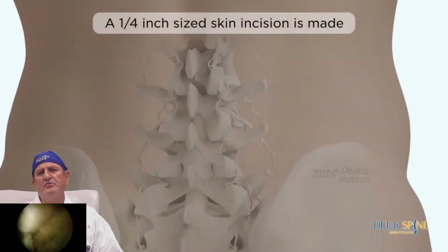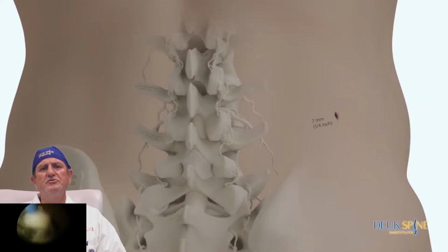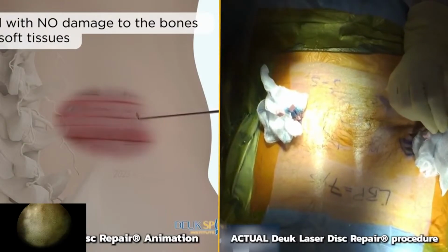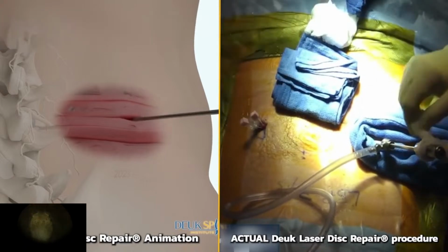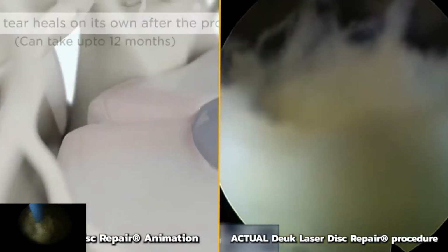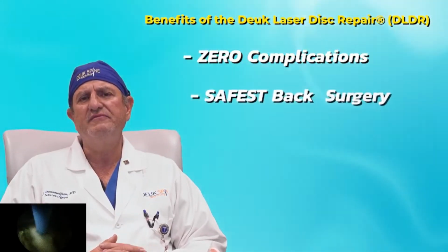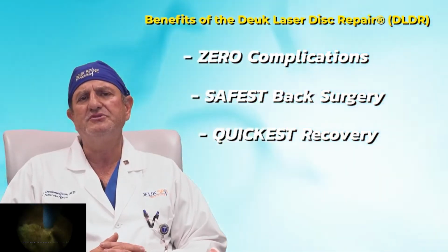In your case, we can fix your back pain by performing a state-of-the-art procedure only available here at Deuk Spine Institute. This is a minimally invasive arthroscopic procedure performed with a laser. This procedure is called the Deuk laser disc repair. We've been performing the Deuk laser disc repair since 2006 here at the Deuk Spine Institute. To date, we've had 0 complications. The Deuk laser disc repair is the safest, most effective treatment for back pain coming from an injured disc like yours.